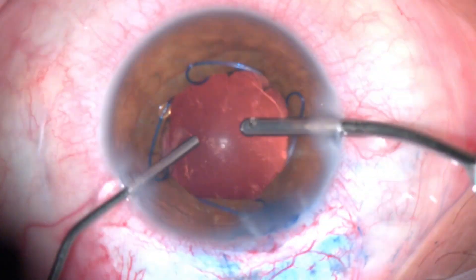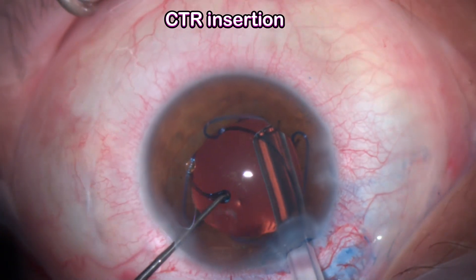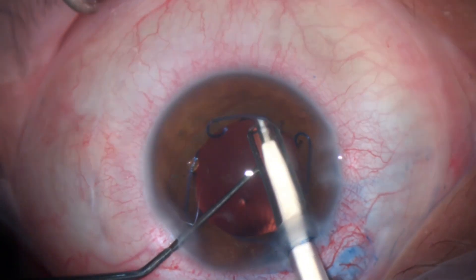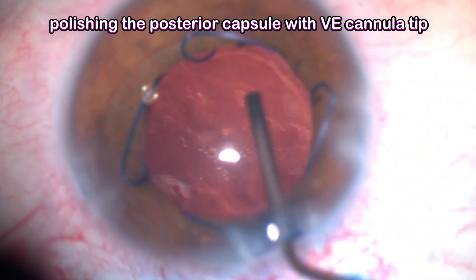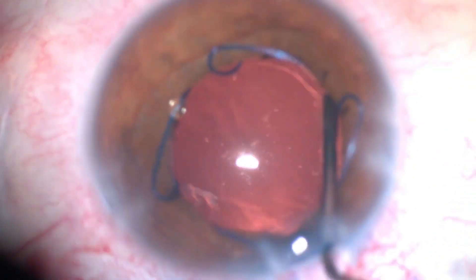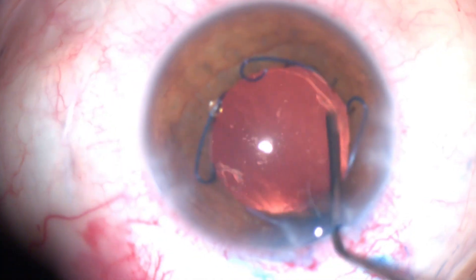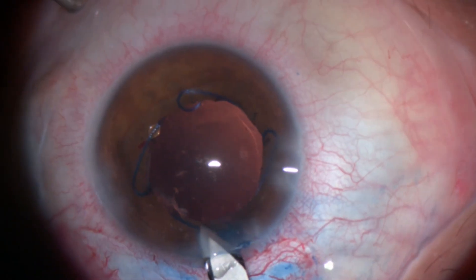I injected some viscoelastic to avoid anterior chamber collapse. I decided to insert a capsular tension ring — I find guided CTR insertion is less traumatic in this scenario. I then did further polishing of the posterior capsule; with the CTR in place the capsule is a little more stretched, allowing further polishing with the viscoelastic cannula tip until the visual axis was cleared.